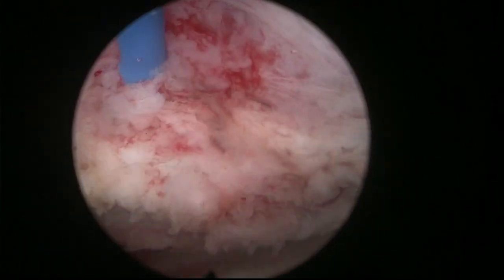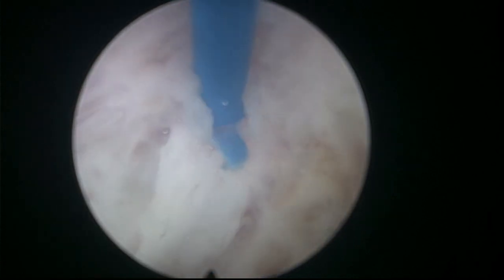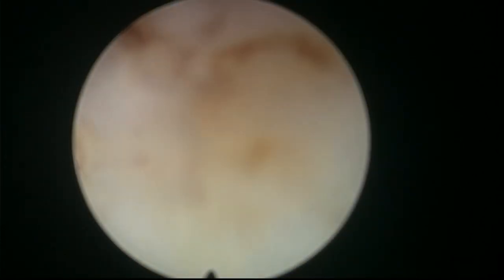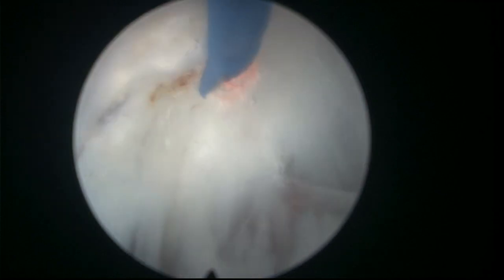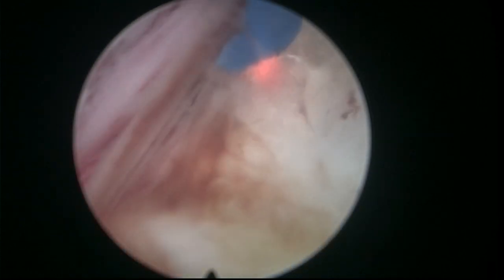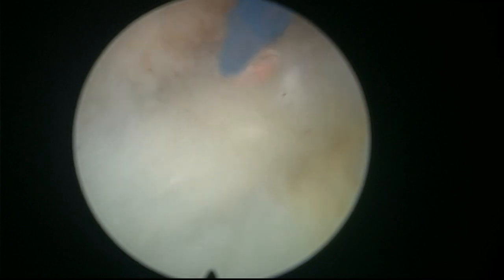Okay, there we are. That's the adenoma, which is now very mobile, as you can see. Let's see if we can, something happened, it moved. That's the bladder neck over there. So let's do this posterior dissection until we get to the bladder neck. Here we have to get close to the adenoma, as I always say, to release.